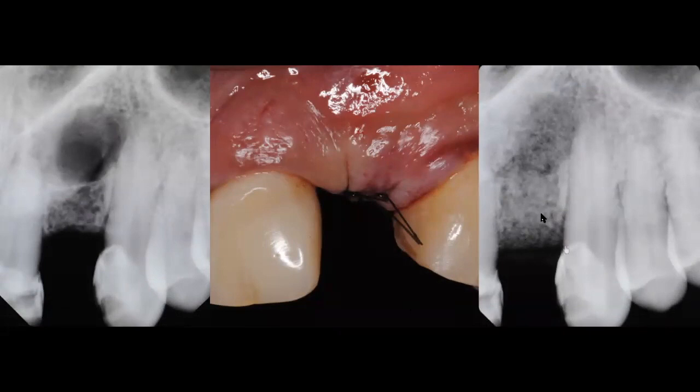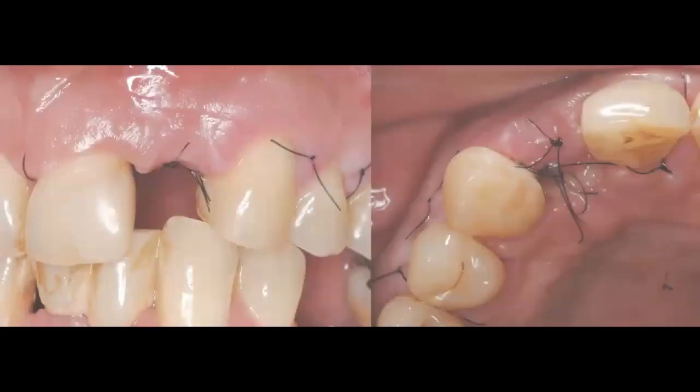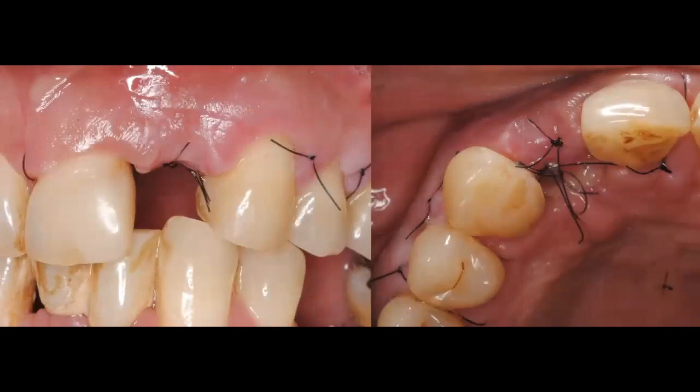Now you can see that we were able to fill the area substantially with our graft material. And that's what an x-ray should look like right after a procedure, where you're grafting a site that looks like the site that I'm grafting for my patient here. And now this is maybe 10 to 11 days after the surgical procedure was performed. And you can see that we have now an initial state of healing. You can see that we were able to achieve primary closure. And you can see now that there's good healing going on.